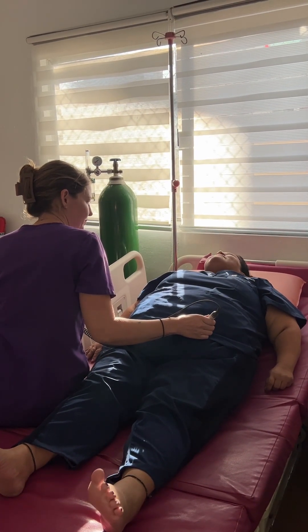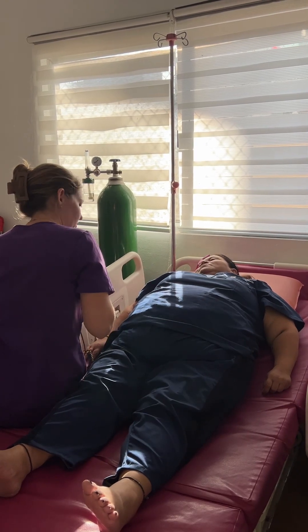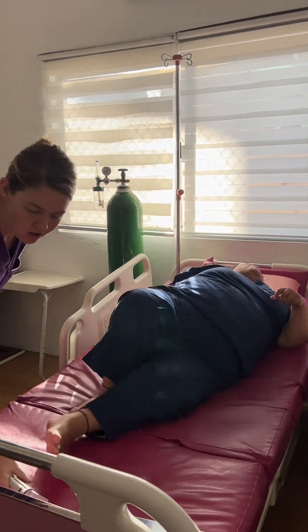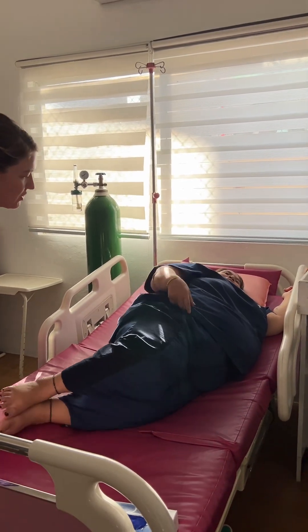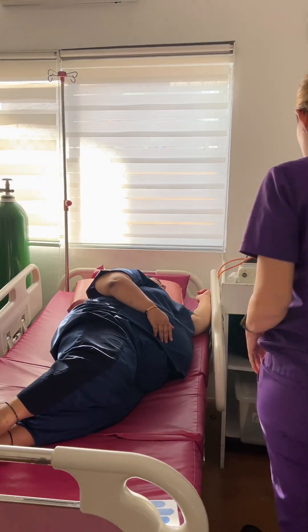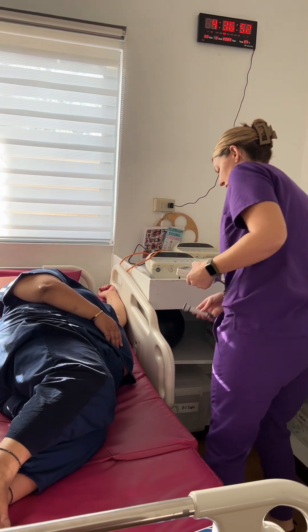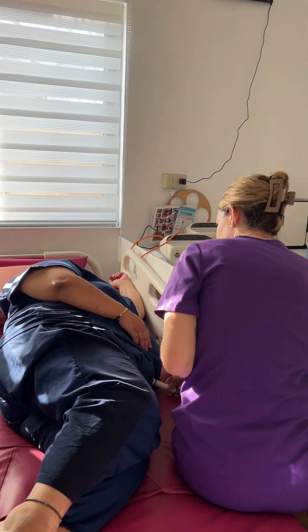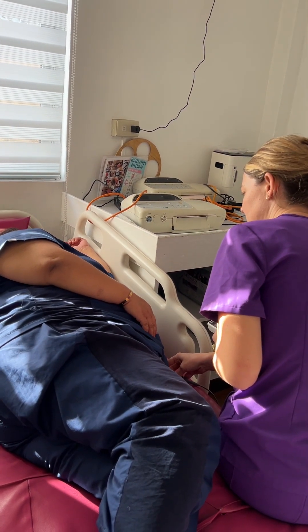Rona, I think that you should move over to your left side — your baby's heart tones are a little low. Do you feel okay in that position? Yes? Okay, let me listen again. Okay, sounds good.